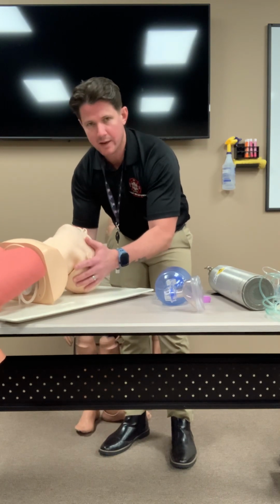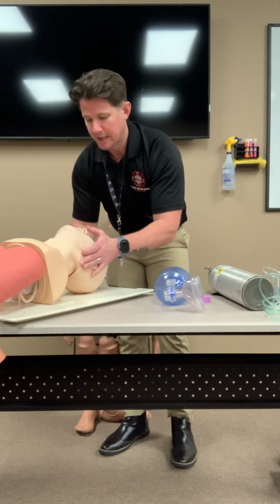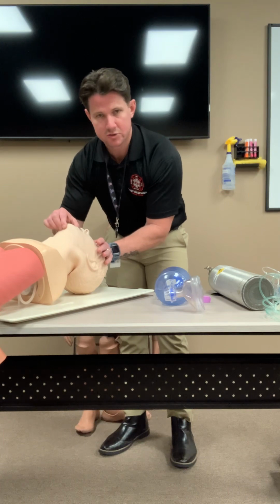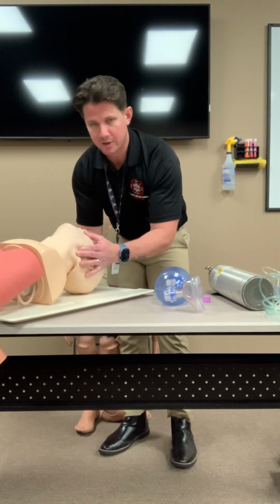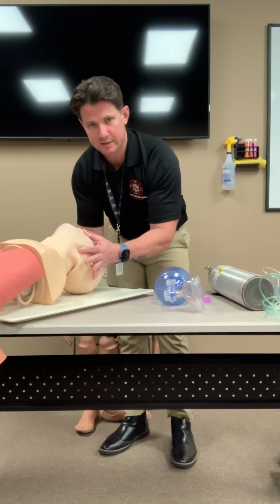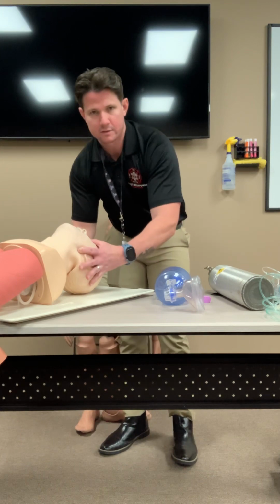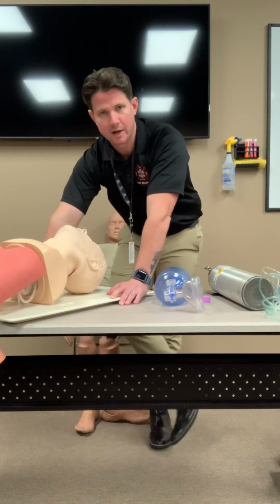I want to align his airway axis and I want to make a good path for airflow, all right? And then using the head tilt chin lift if you don't suspect trauma, or the jaw thrust if you suspect trauma, right at that jaw joint, that temporomandibular joint, just articulate it up, open his airway, and look, right? Remember, we should not start ventilating before we look in the airway, right?